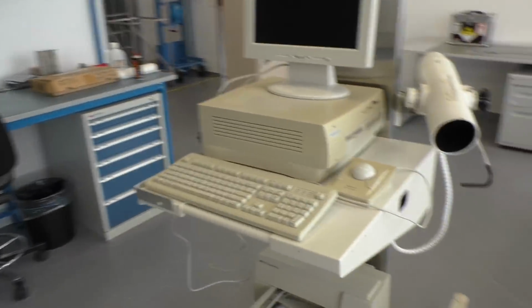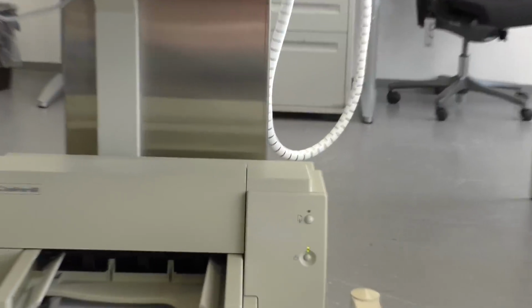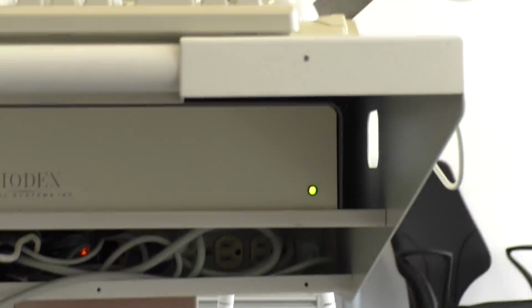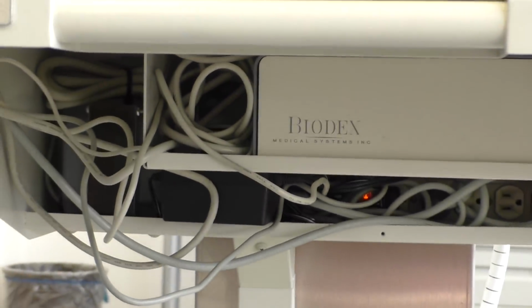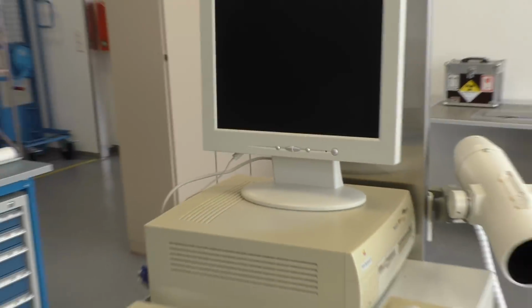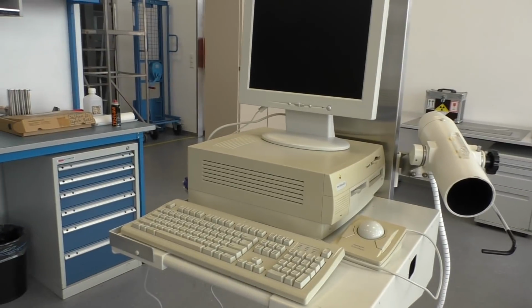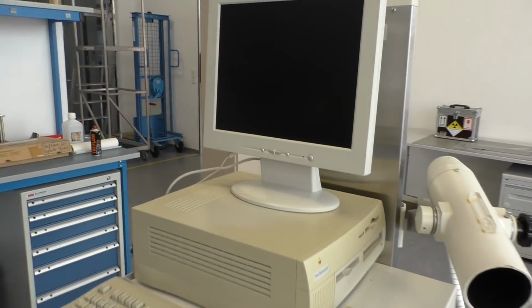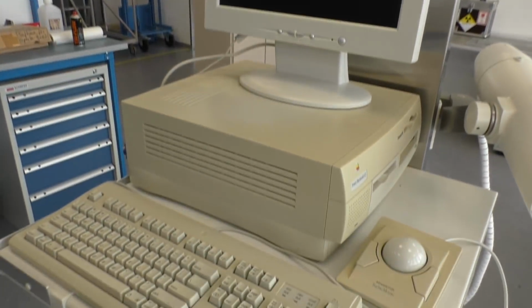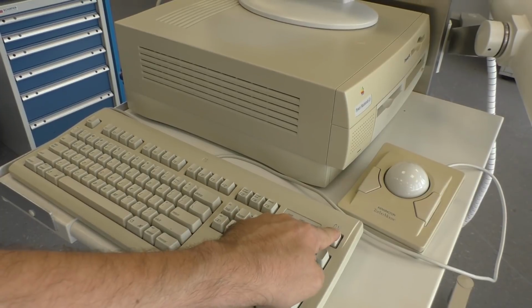Well, I checked all the voltages, and let's plug it in and see if it's still working. It seems the printer has power, that box has power, power strip. There's also a light that comes on. Monitor is still dark because it's plugged into the Macintosh. Now I show you something that I really miss on the modern Macintosh. It's the power button on the keyboard.